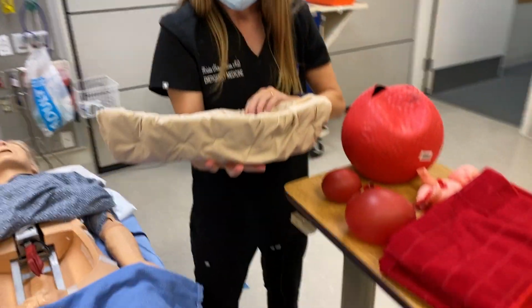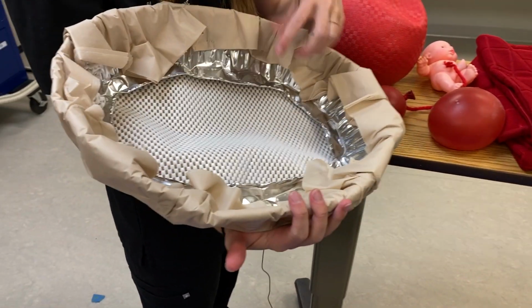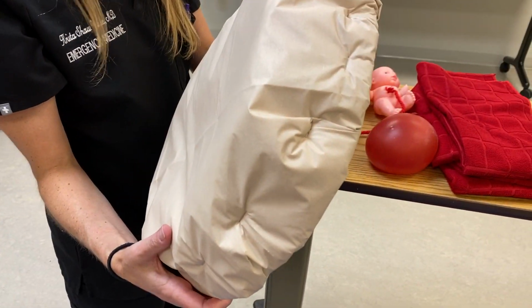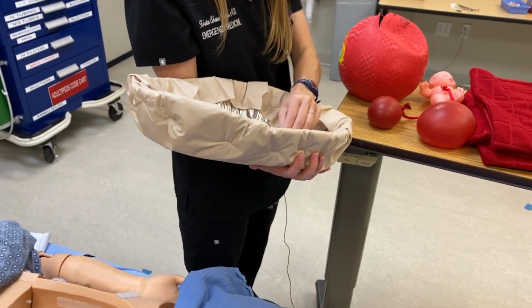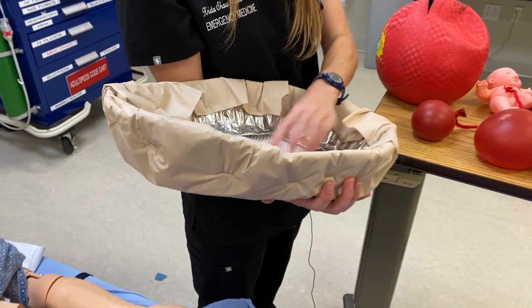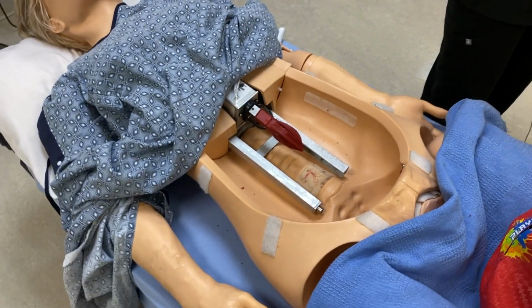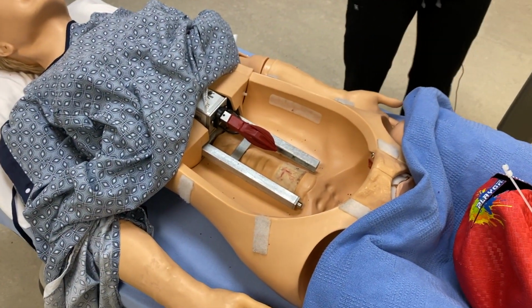And then this is the belly I built. It's just a turkey basin that I cut the bottom out of. And then I used a tablecloth that's kind of flesh colored for the skin. And then this is like what you put under a bath mat for the fascia and peritoneum, which we will cut through. Okay. And then we're using a mannequin from our sim center that is a delivery mannequin. Yeah. We just took all the equipment out of it.